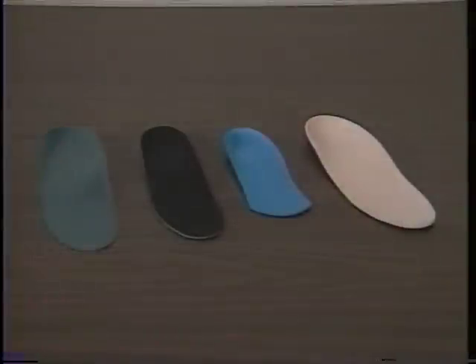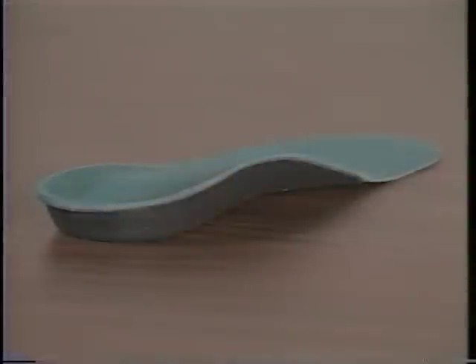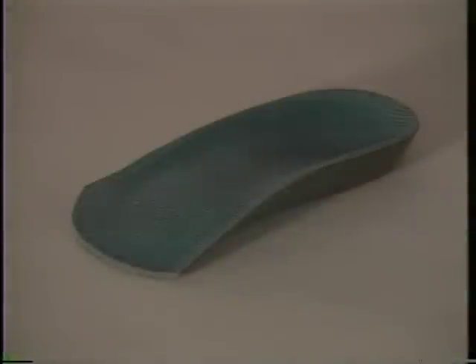Four different types of BioThotic devices are available. The ProFunction BioThotic is a thin semi-rigid orthotic designed for men's dress shoes and women's casual shoes. The ProFunction orthotic can be trimmed up to the metatarsal heads if the shoe is too tight in the toe box area.